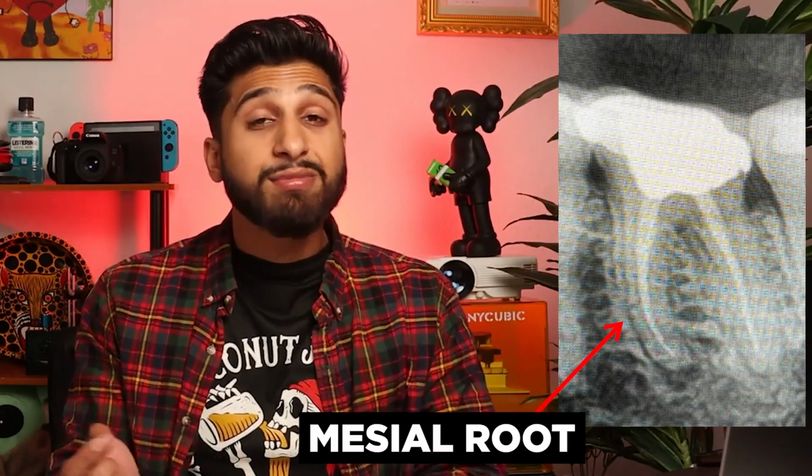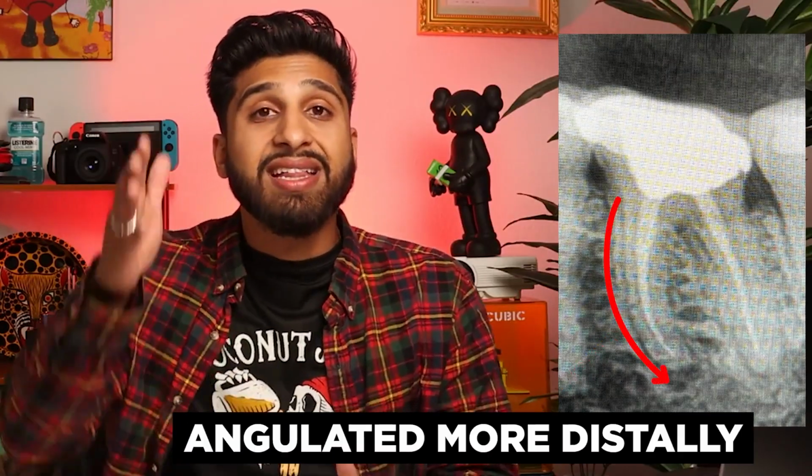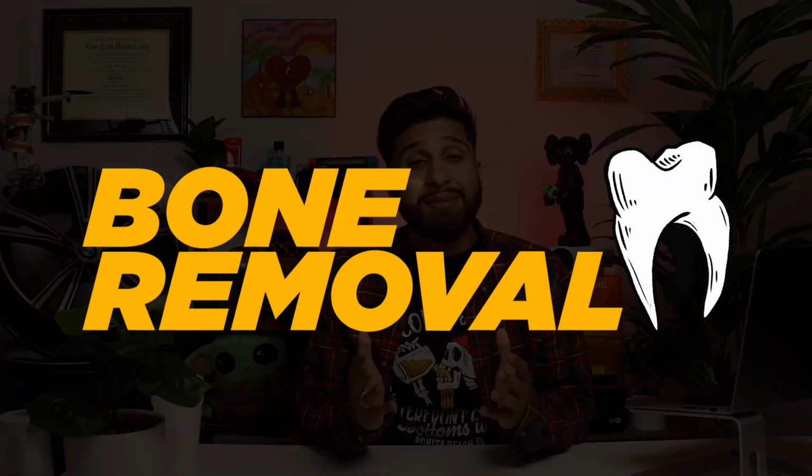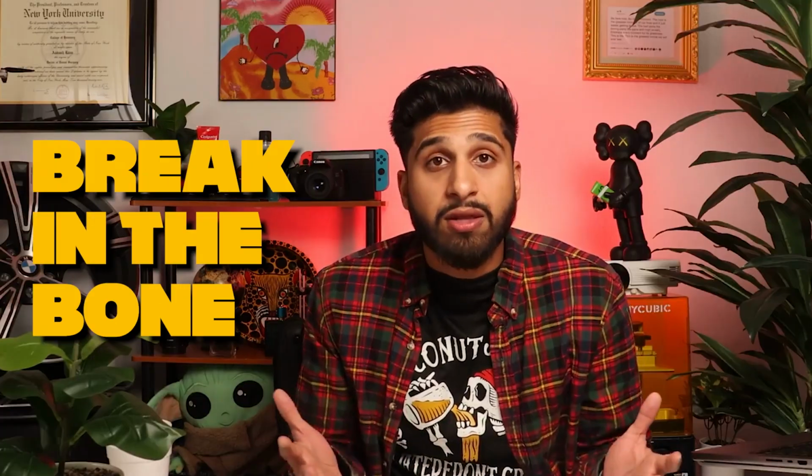Additionally, I carefully observed the curvature of the roots. I observed that the mesial root was angulated more distally. Conversely, that distal root right there presents a more straightforward configuration. I noticed that the curvature of the tooth doesn't allow for a straight path for the tooth's exit. Therefore, it became more evident that some bone removal may likely be necessary, as this tooth may break in the bone. To accomplish this, I'm anticipating that I'll need to use a surgical handpiece to fully get the tooth out.